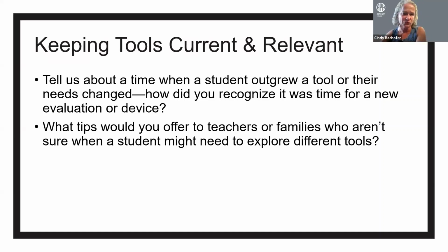So looking through that day, whether it's classroom or beyond the classroom, and identifying specific tasks, getting good. Even if the student just says, okay, I'll work on these 2 or 3 tasks. If you have a reluctant student, give them some control over it: I'll choose when I'm going to use the tool.